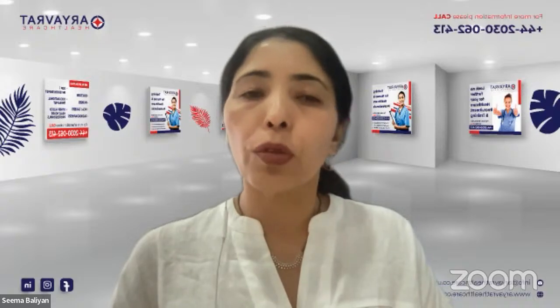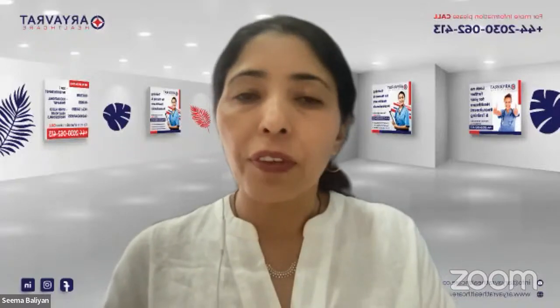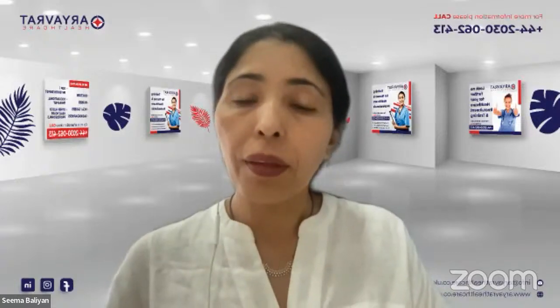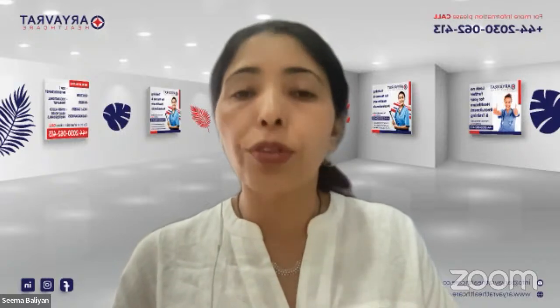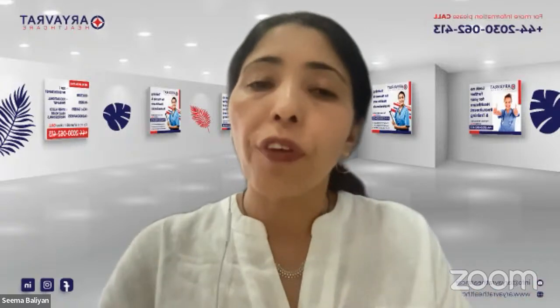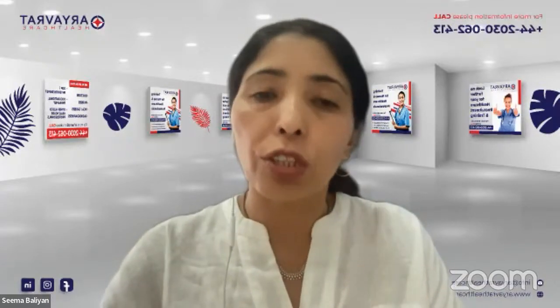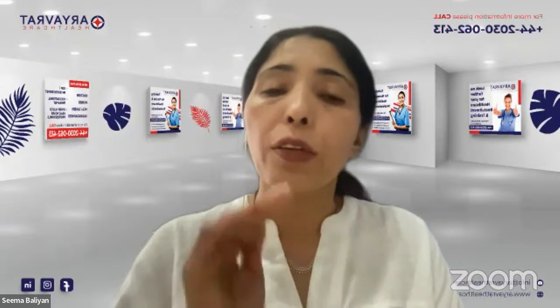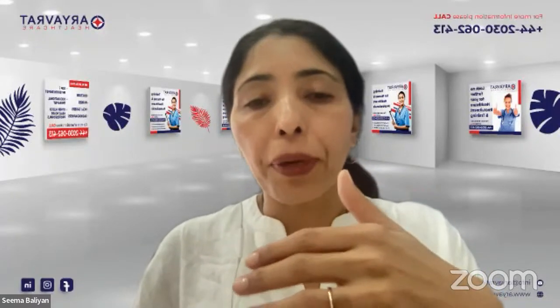So once I have got my final lung capacity, now I need to know whether this lung capacity is normal or not normal. In order to find that out, I will need to know what is normal. And in order to find out what is normal, we have a chart called a PEFR chart, or a peak expiratory flow rate chart. And in that chart, it will tell what is the expected or the normal reading for a person.